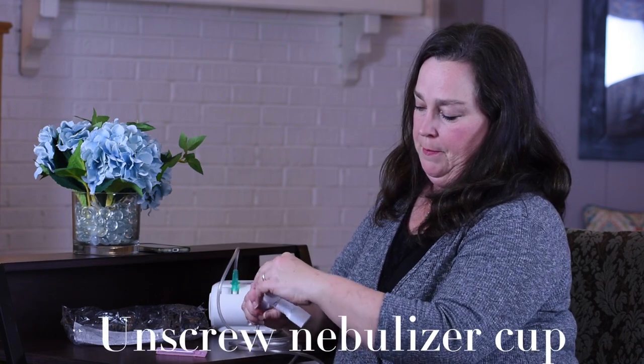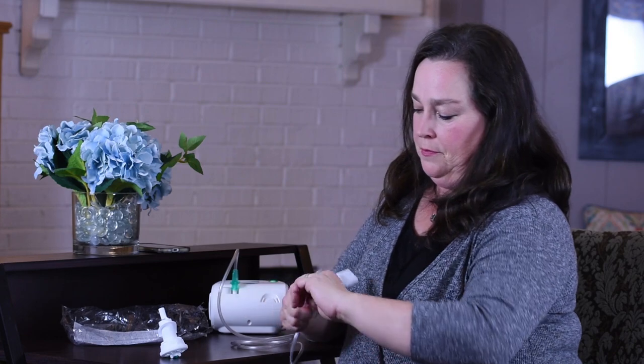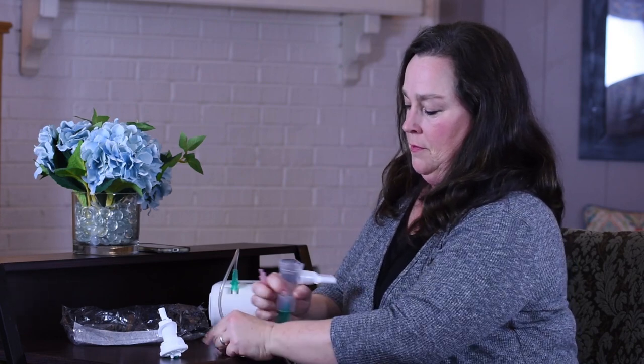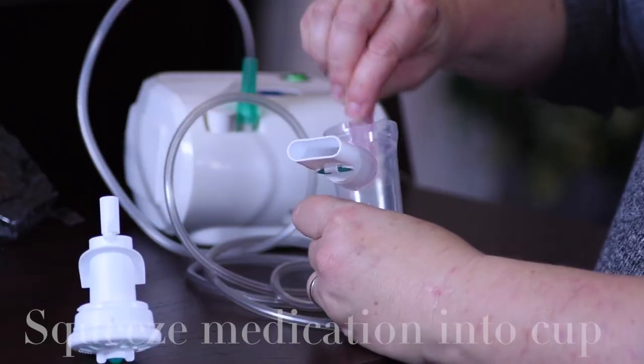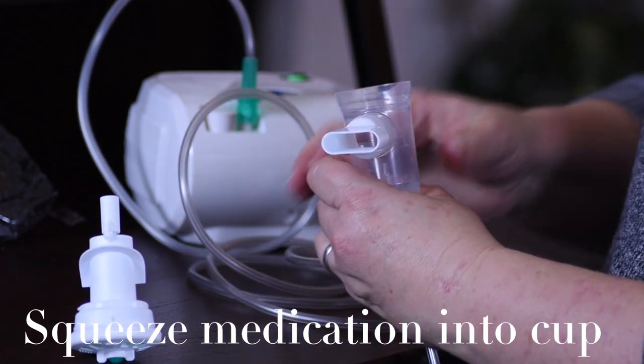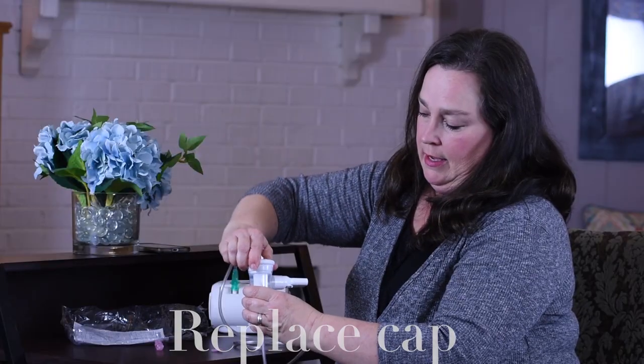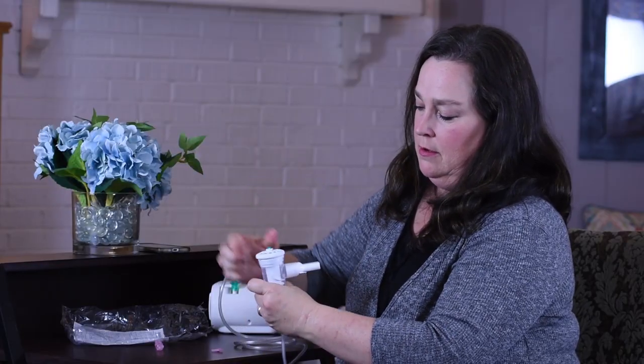Now to put your medication in the cup, you will unscrew the top of the nebulizer cup and squeeze your medication into the cup. Replace the cap by twisting it back on securely.